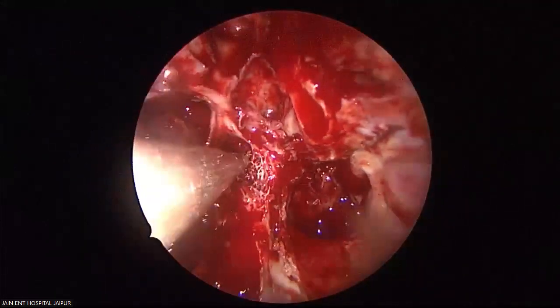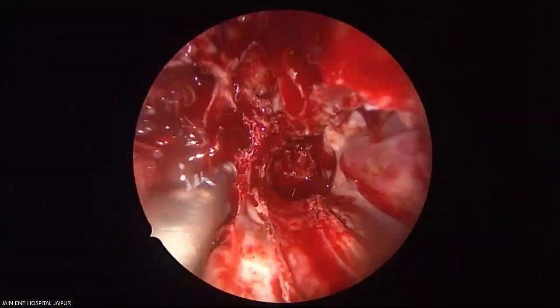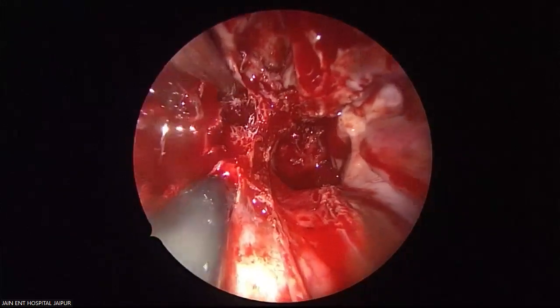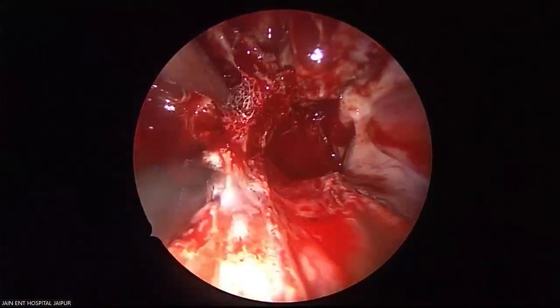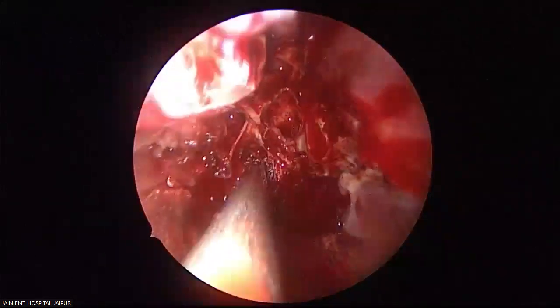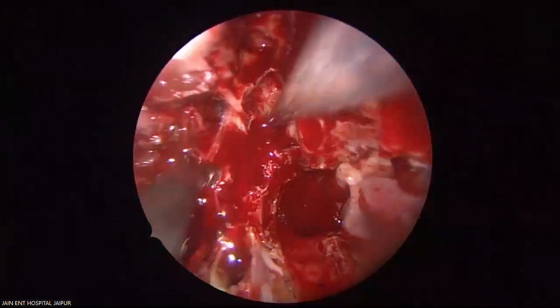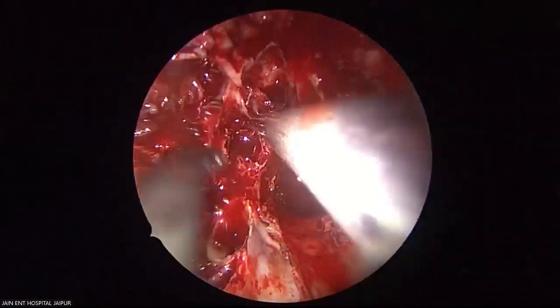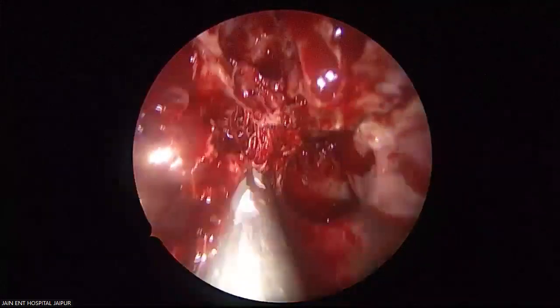This is healthy bleeding coming from the pterygoid. See this healthy bleeding? This won't allow the tumor to stay. That's the pterygoid fossa. This honeycomb bone now, I am completely going to destroy it. The reason being, this could be a potential source of so-called recurrence. To me, the tumor has been completely removed.